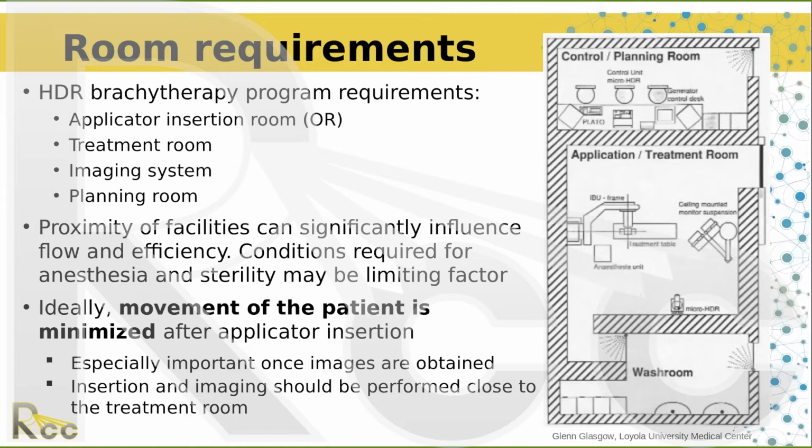If you're stuck with the facility, and I'm sure some of you have learned, well, I didn't have a choice of where I was going to put that room, and that really adds an extra 10 minutes to every procedure. So if you have the opportunity to build that flow, it's really worth the extra time and thought, because you want to minimize the movement of the patient. Once the patient has an applicator in them, any kind of movement could displace it, and that could lead to some of those complications we talked about earlier.